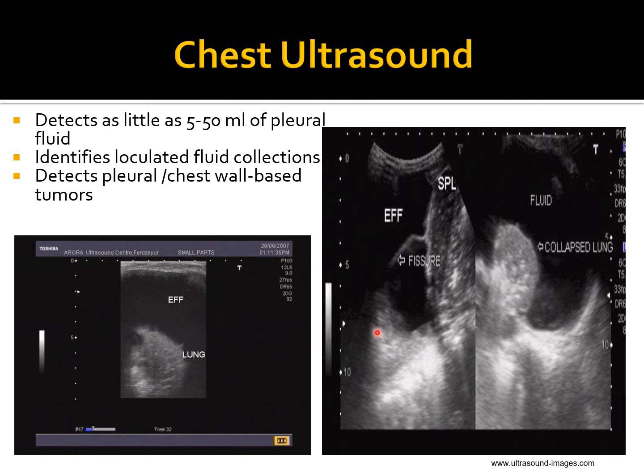Now this is another ultrasound. There is fluid here. There is the collapsed lung. In this case, this is the hemidiaphragm. Okay, this is the effusion. This is the spleen. But you can see here a band-like density, which is a fissure. A fissure of the lungs that is seen on a chest ultrasound.